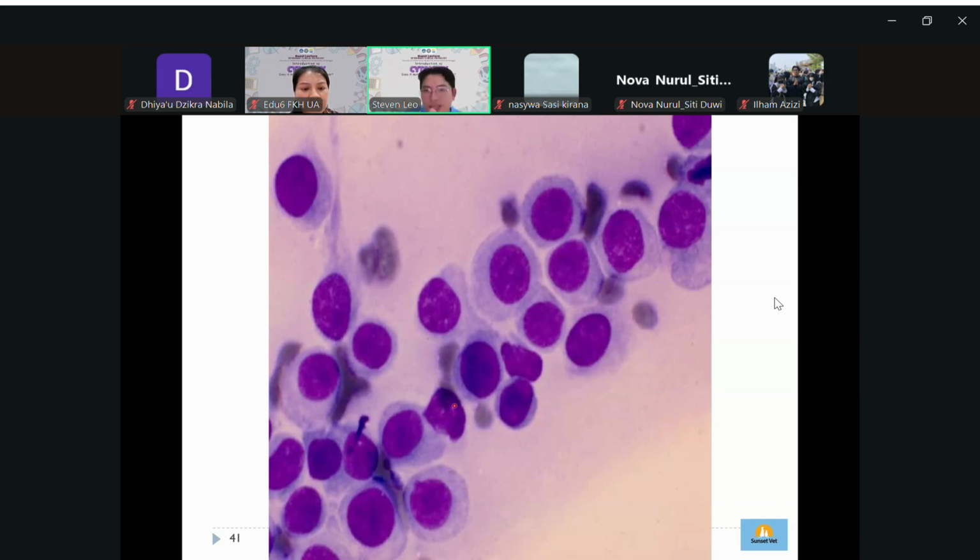So do you think the nucleus is in the center or more to the margin, more eccentric? On the center, right? It's more on the center here. And the nucleus size is not that big. So this one is beautiful also. This is typically the histiocytoma.